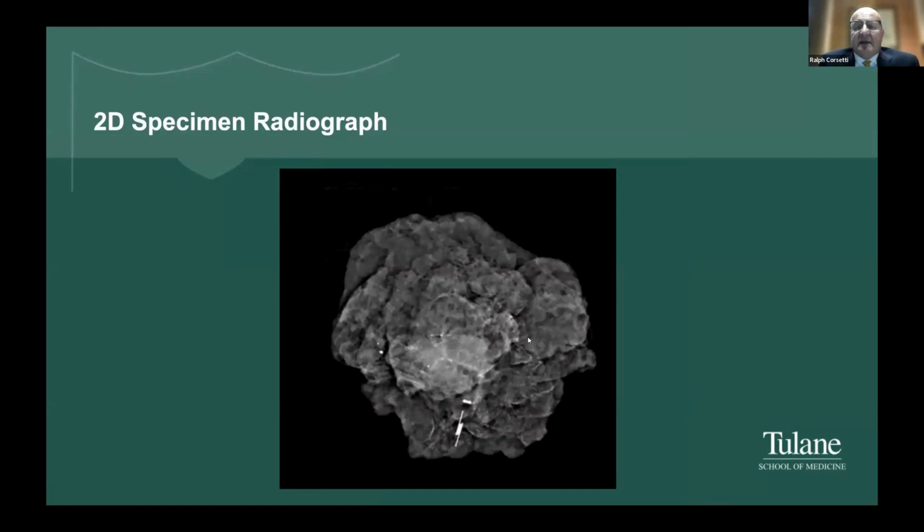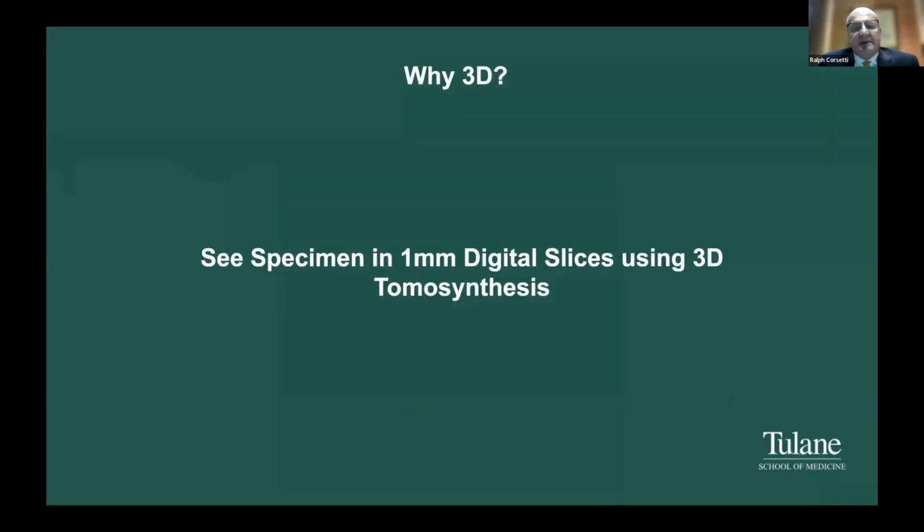So these are coronal images on the left, where superior would be up at the top of the screen, inferior at the bottom of the screen, laterally to the right, medially to the left for a left upper outer quadrant mass. I take coronal images with the 3D specimen tomosynthesis. So I intraoperatively re-excise this inferior medial, and then on the 3D tomo, we had very good anterior margins. Grossly, I try to achieve a 1 centimeter grossly clear margin. It was slightly closer to the posterior side. So I re-excised this inferior medial posterior, I call it a hemiquadrant.